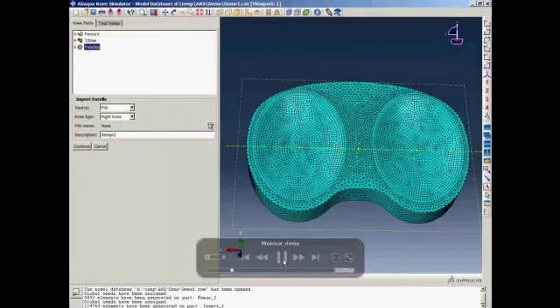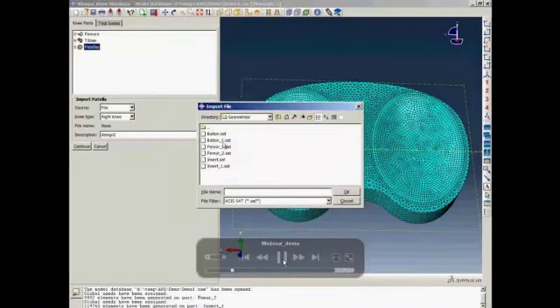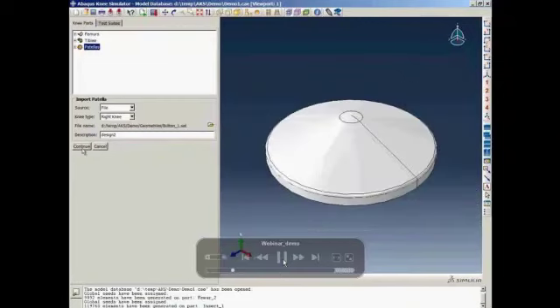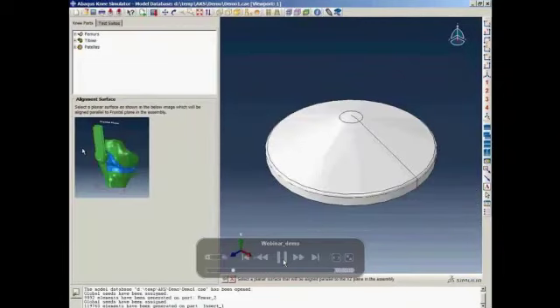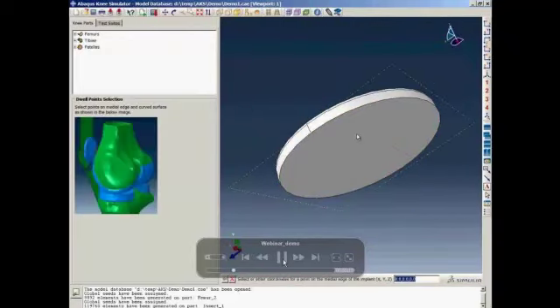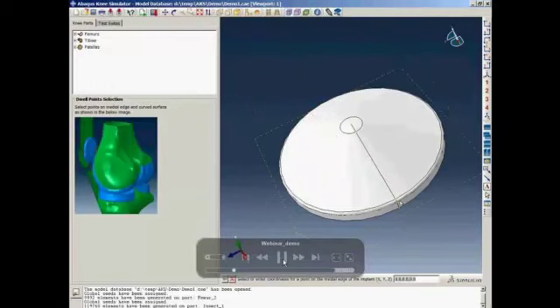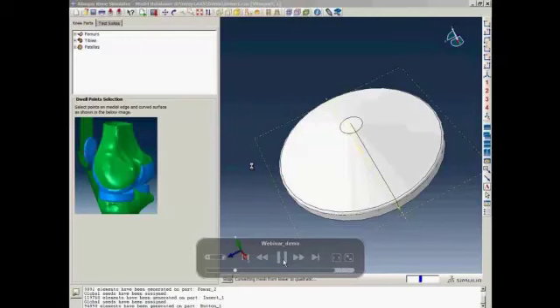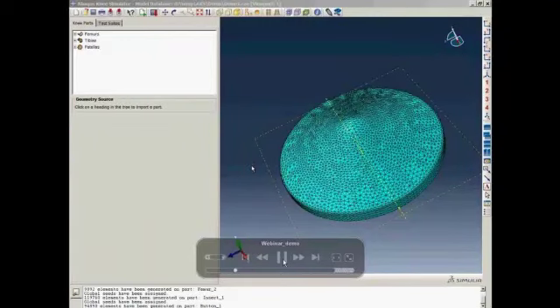Next, we import the patella button components. Again, one planar landmark is required, and 2 landmark points on the patella button, one on the medial edge and one on the curved surface. Again, the user can either mesh it in Abaqus Knee Simulator or skip this for a part that has already been meshed.